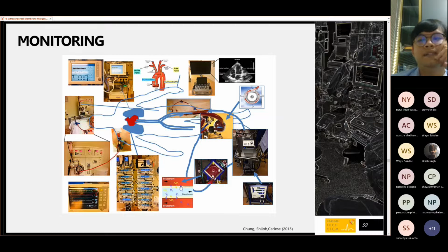It looks complicated like this. So you can see the patient is here, right? Okay, we're going to start from the components first. What you see here is the Ecmo cart. Here is the oxygenator, which is the exchange, right?